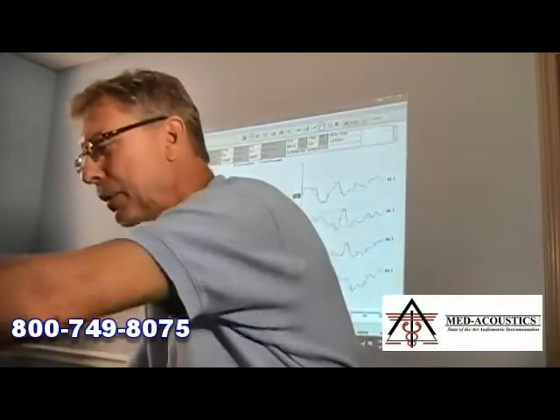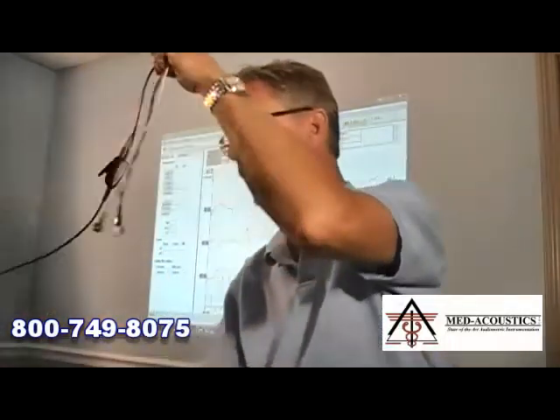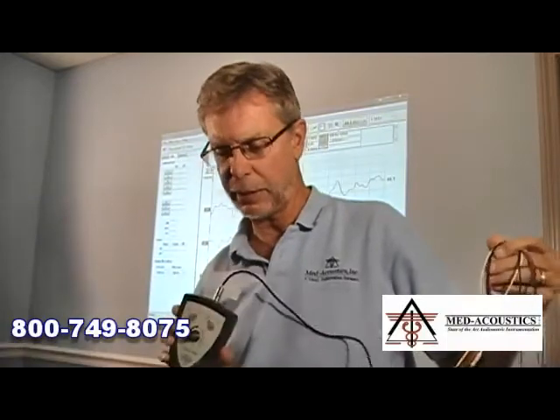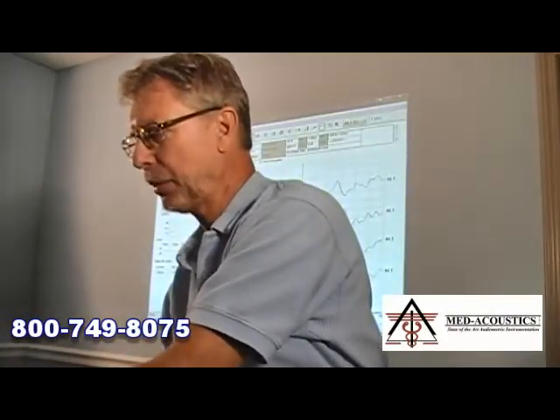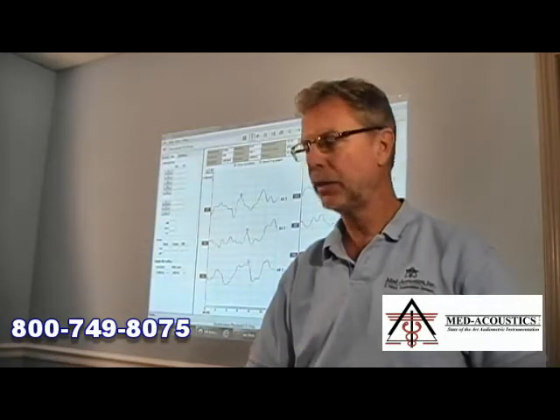What it does is prove that the design of the preamp is such that it has a good deal of noise immunity. This is the preamp. It's lightweight. It can sit around the person's neck, or even clip onto them. And then there is a short patient cable. And there's an impedance tester, a very easy to use impedance tester that's built onto the front of it. So the design of the preamp gives it an extraordinary amount of noise immunity.